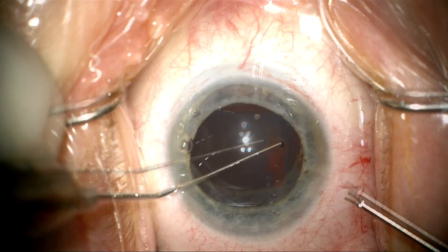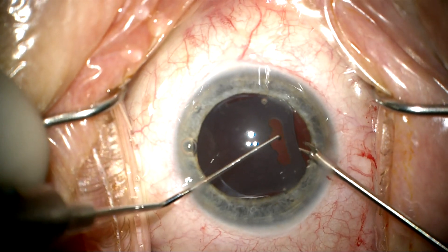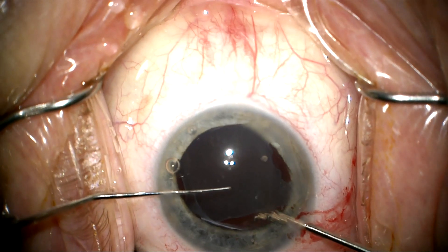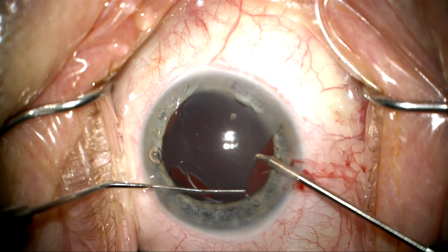Now I'm going to pull this lens up out of the capsular bag, and it comes out pretty easily, to my relief. There doesn't seem to be that much fibrosis. We're going to pull the other side out. This is a plate lens that's not available in the United States.